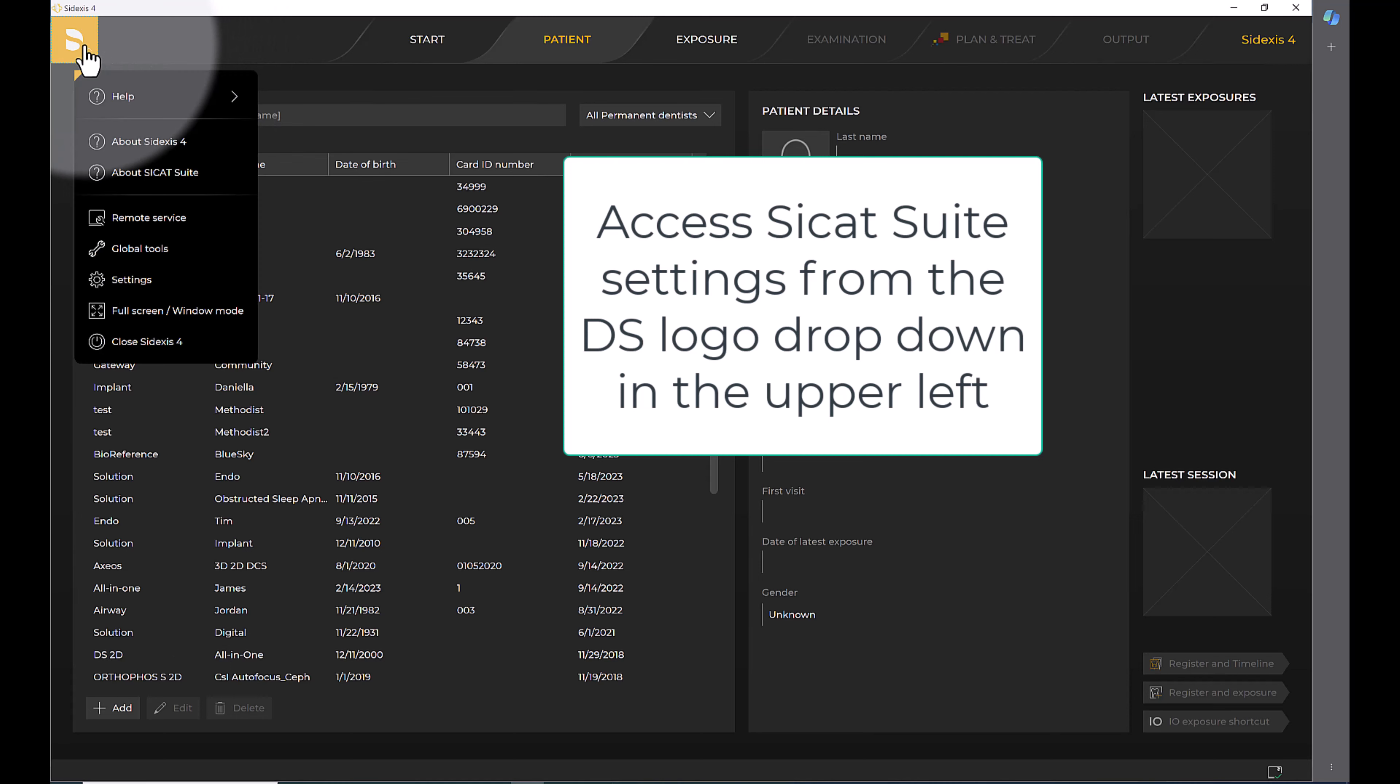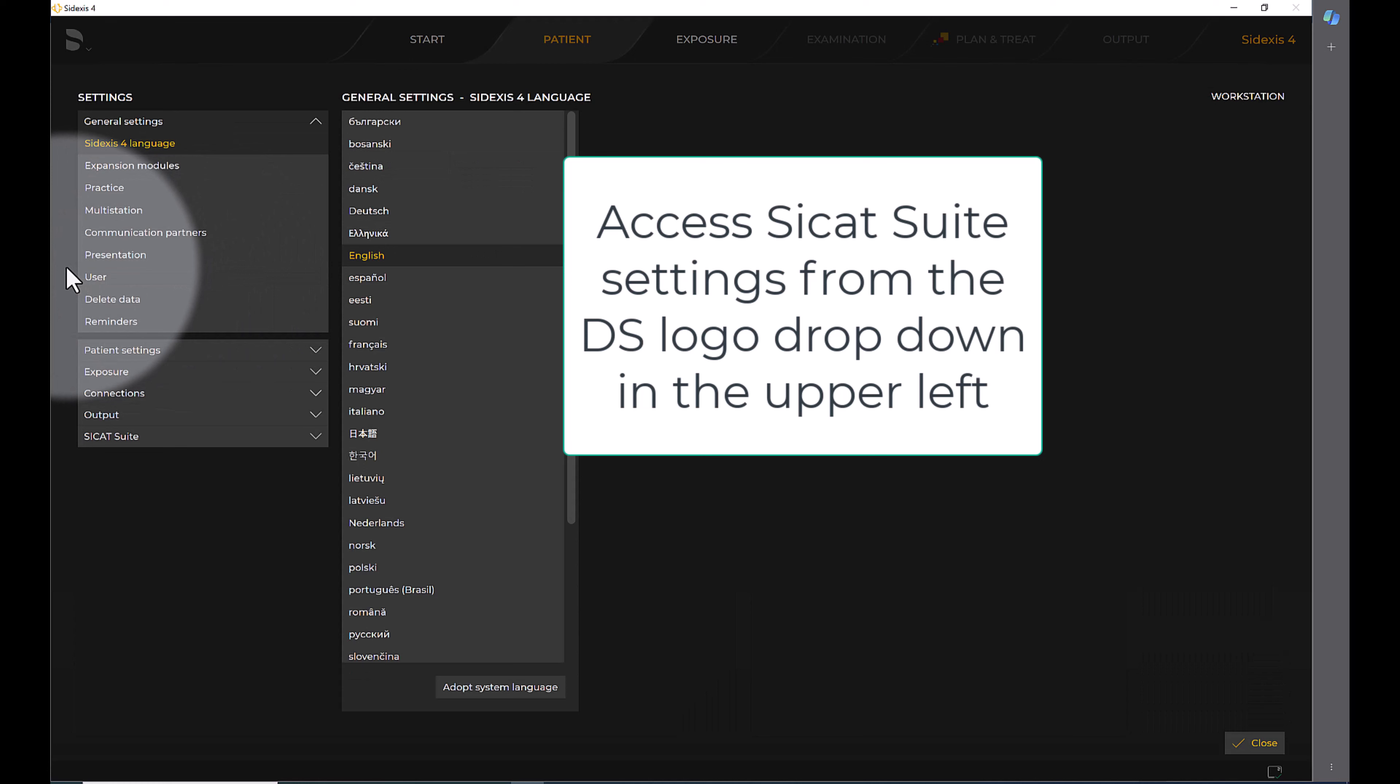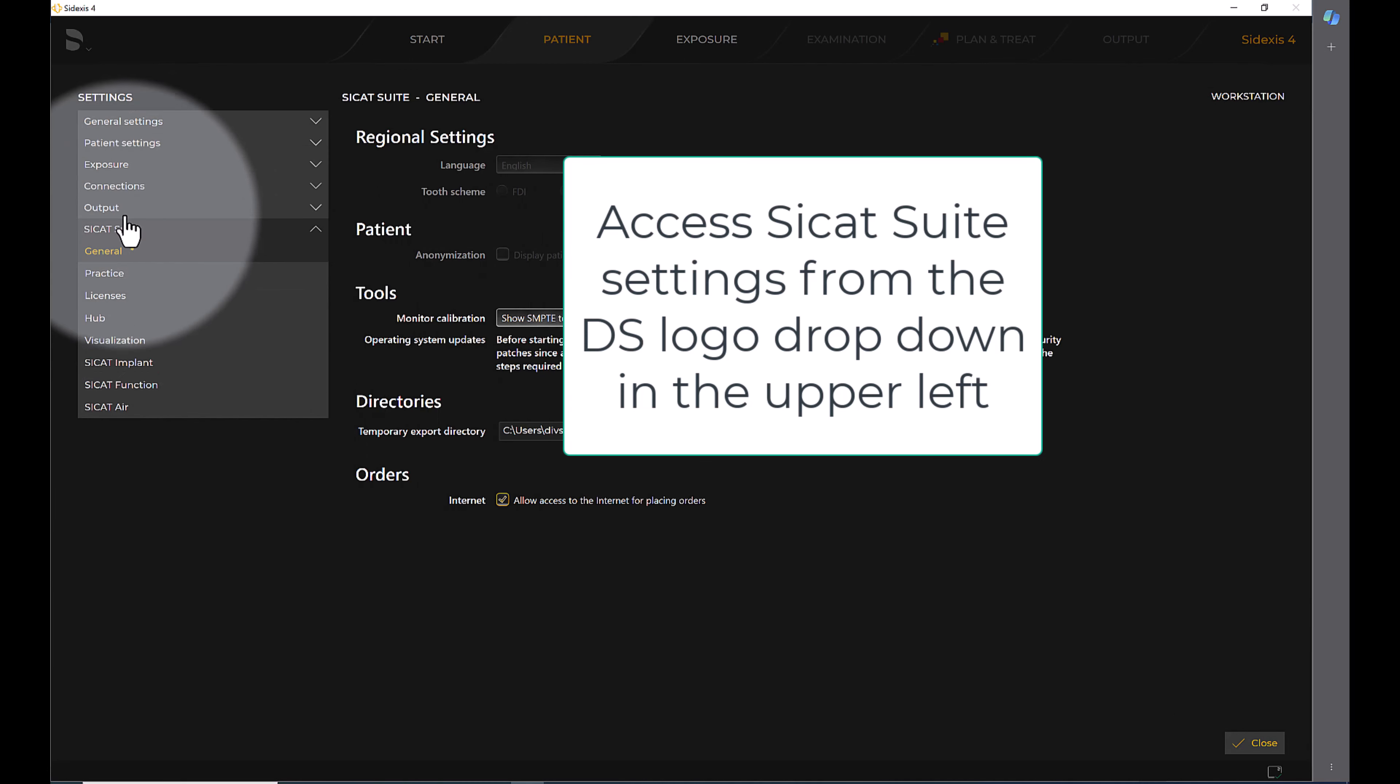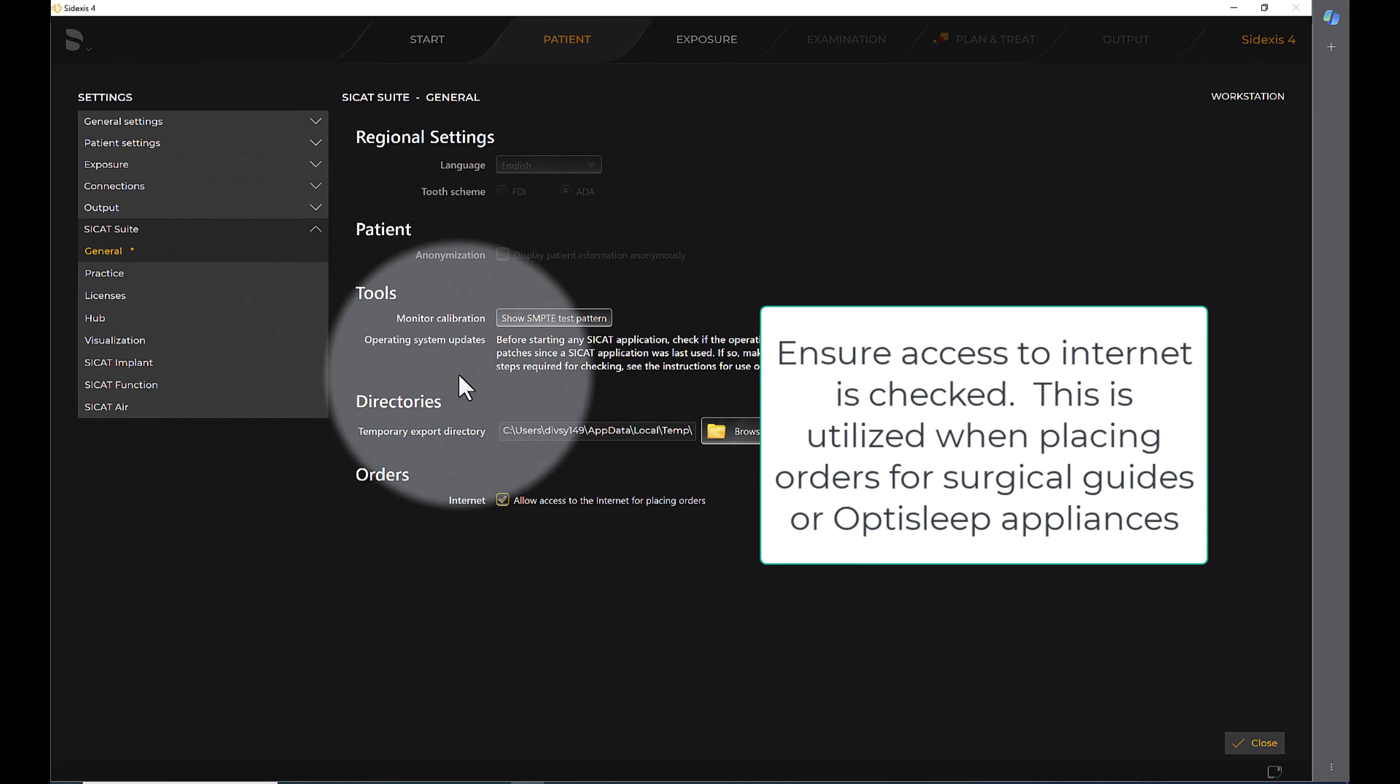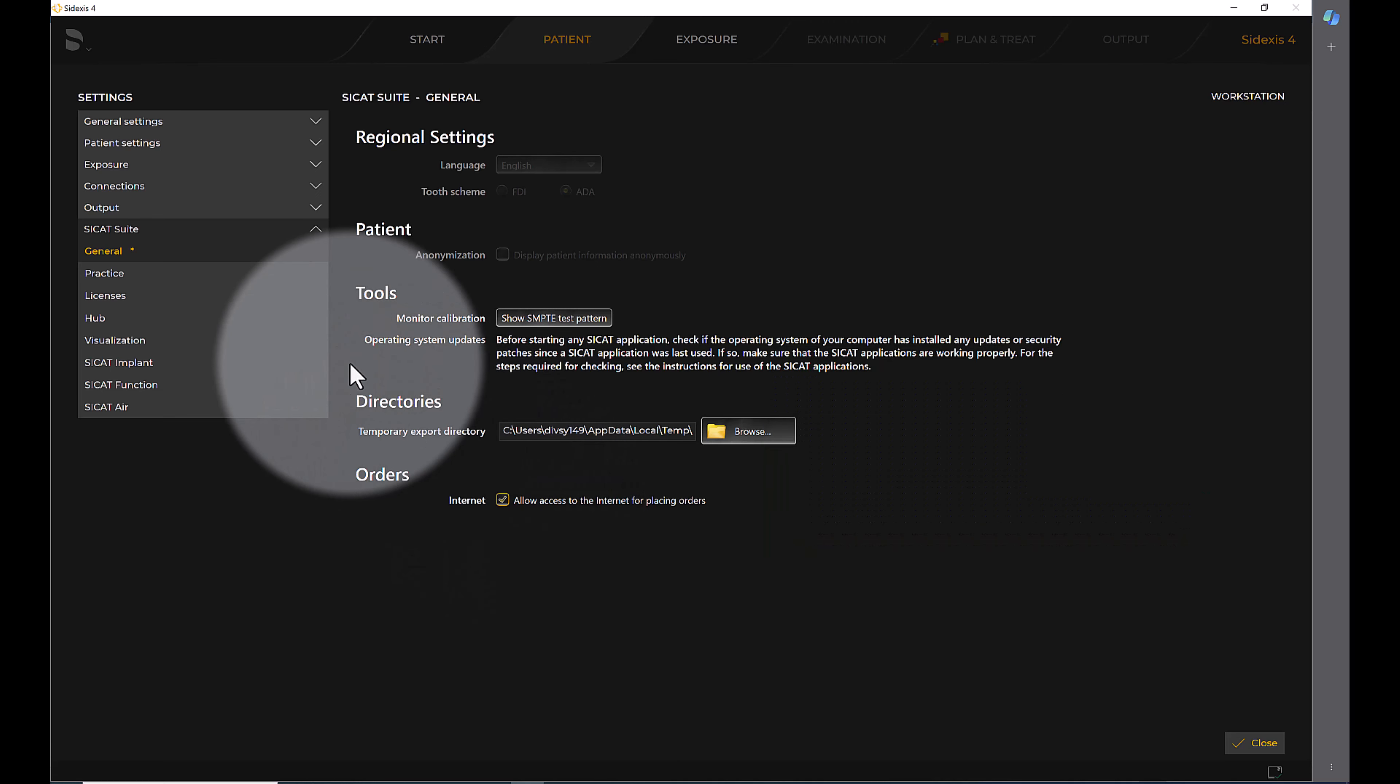Access CCAT Suite settings from the DS logo dropdown in the upper left. Ensure access to internet is checked. This is utilized when placing orders for surgical guides or OptiSleep appliances.